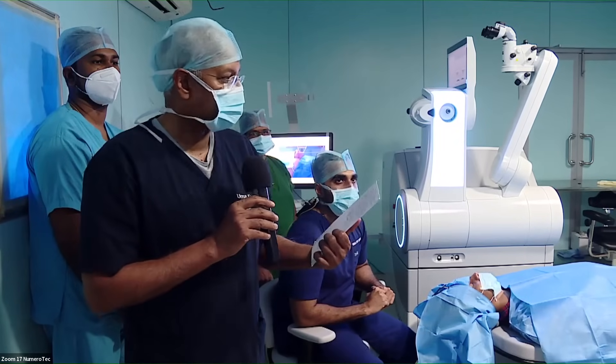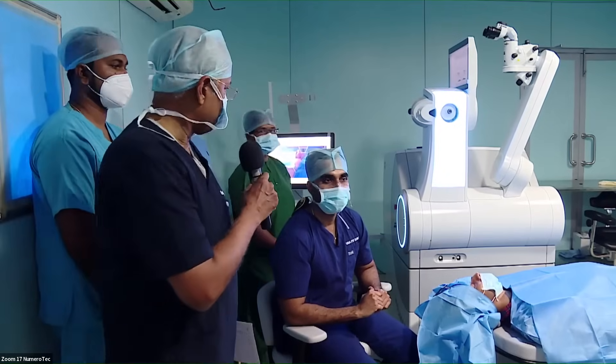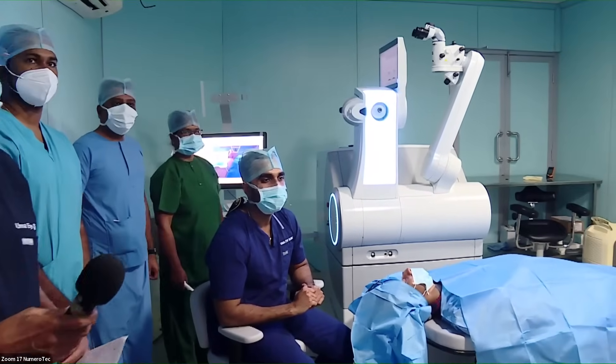We're going to do a SMILE now with the latest new SMILE Pro machine. Over to Dr. Aditriya. Hi, good morning.